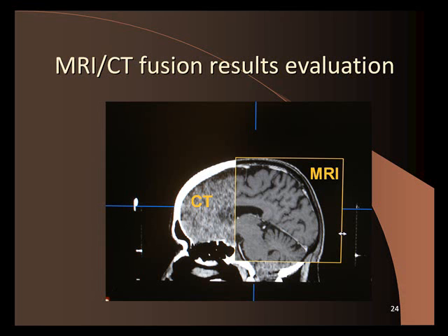And so the purpose of fusion is, say the physician can't see the tumor on CT, but they can see it on MR. So the physician will go into MR and draw the tumor with the mouse on MR, and then we don't look at the MR anymore, then we do all our planning based on CT because it's geometrically accurate.